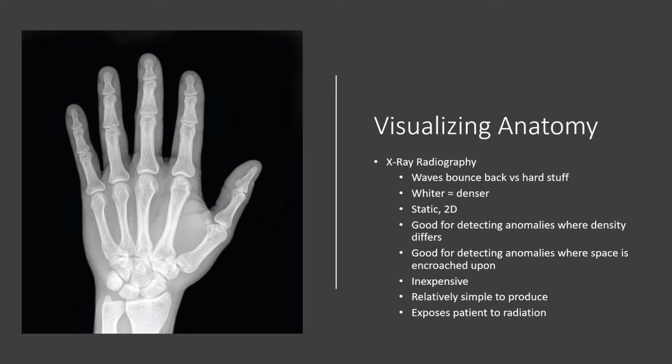So it's one of these things where if you can get away with an X-ray, it's worth trying to get away with just doing an X-ray. It saves time, it saves resources. You don't need the most sophisticated, most educated people to interpret them. You do have to be a radiologist, but you don't have to be the best in the world to interpret an X-ray. It's a really good approach. It's very clear. The major downside is it does expose your patient to radiation.